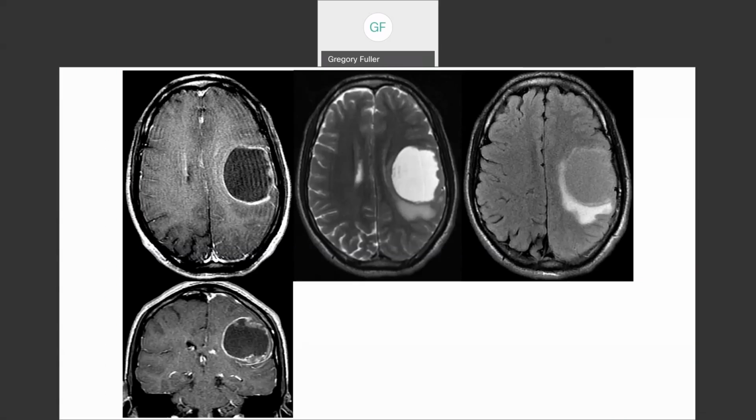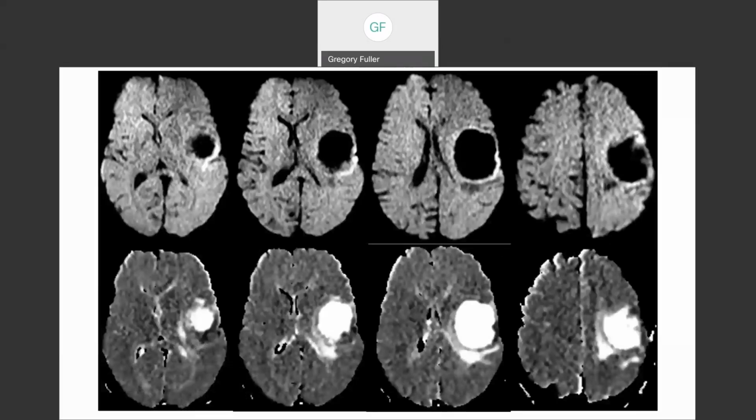You can see it up here. It's a little nodular, all right? It's got some stuff going on in the wall, okay? So now you have age of the patient, gender of the patient, anatomical location, imaging characteristics, all right? Because this study was done, and I thought it was really nice, even in a cystic tumor, I'm going to give everyone a chance to identify sequences.